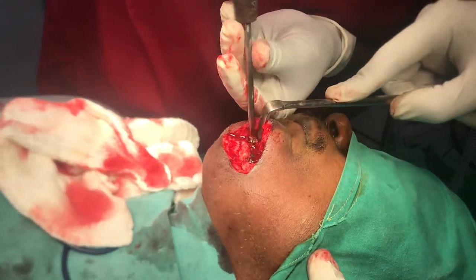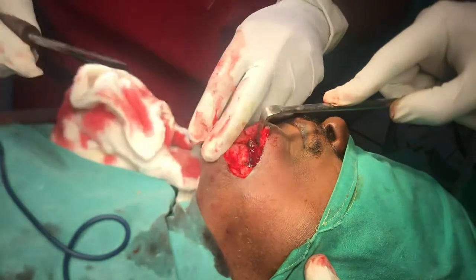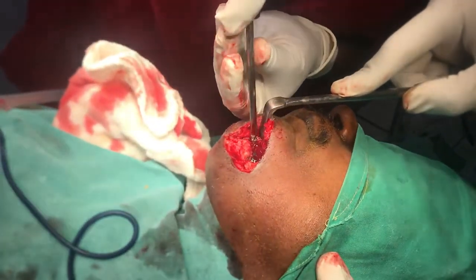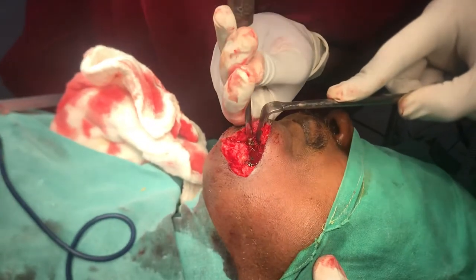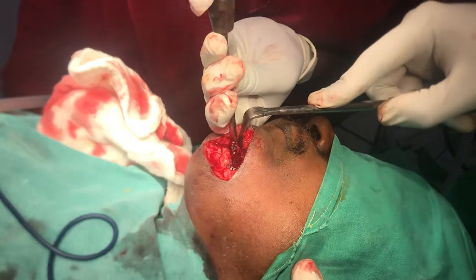We're removing the last two. We used an extraoral approach because that's how it seems to have been done the first time — there was a scar there. We use the same scar to approach, plus there was a sinus tract, so the sinus tract was removed.